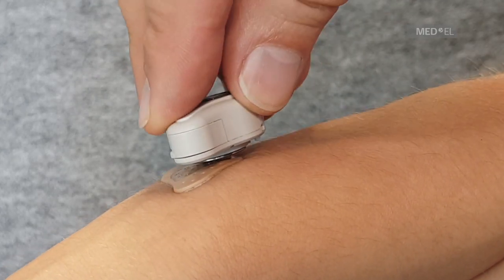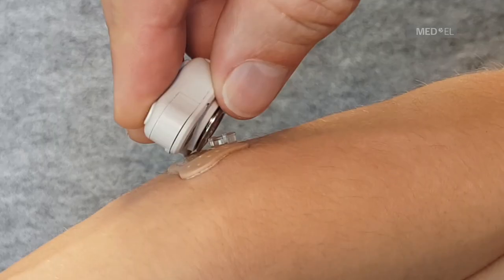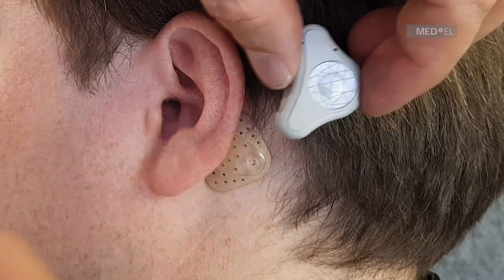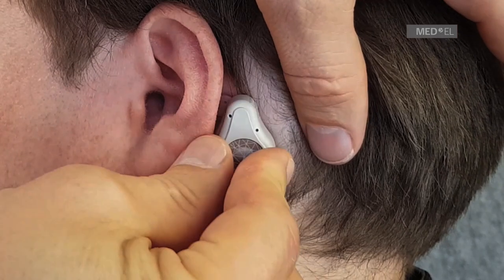When you connect the audio processor to the adhesive adapter behind your ear, make sure no hair gets between the two parts. Tilt the audio processor onto the adapter from behind the ear. For optimal hearing, make sure the audio processor does not touch the outer ear.